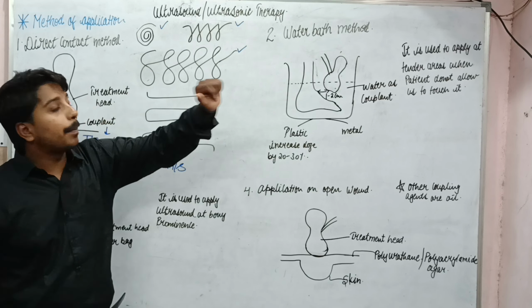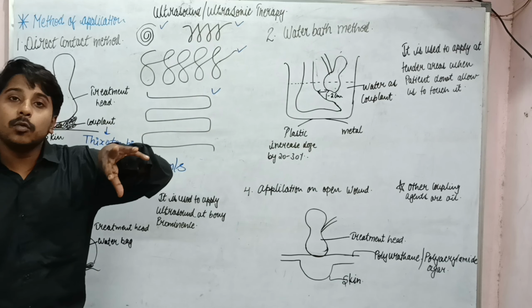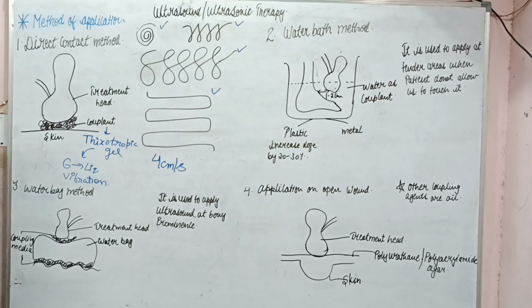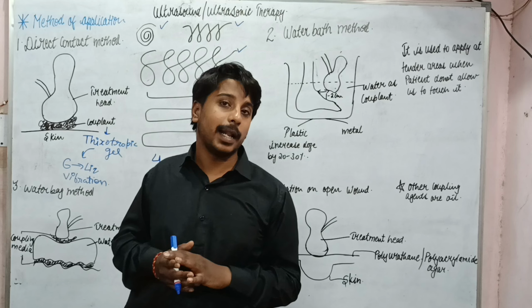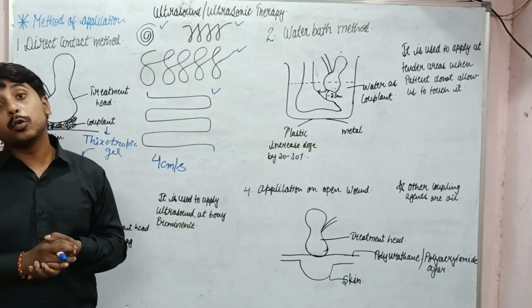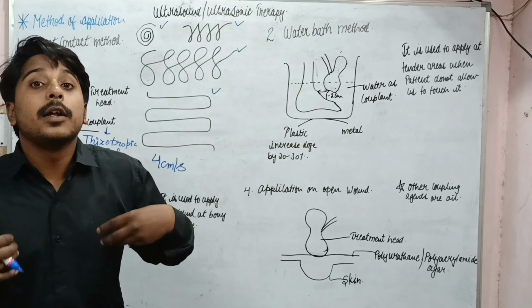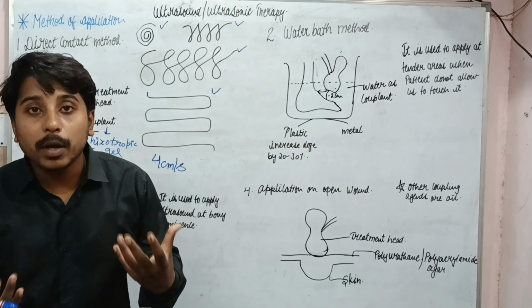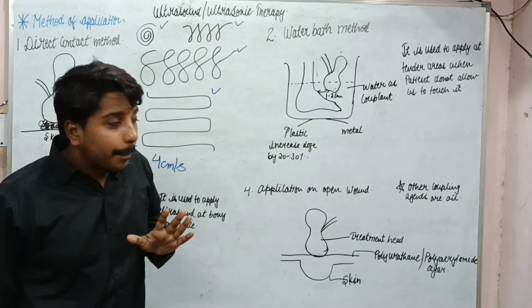Next is the water bath method. First of all, you need to understand why we are using this kind of method. If we are using direct contact, there may be some instances when there is so much tenderness at the affected part that the patient is not allowing you to touch it. If the patient is not allowing us to touch the part, how can we place the ultrasound head, and how can we give the treatment to the person? In that case, we are using the water bath method.